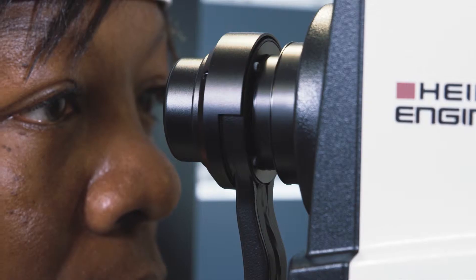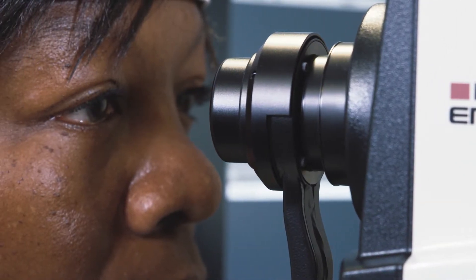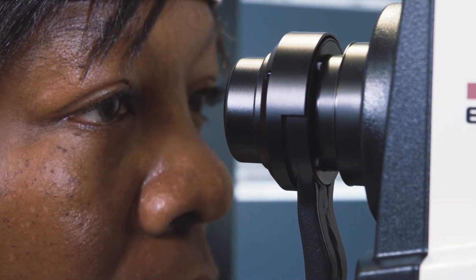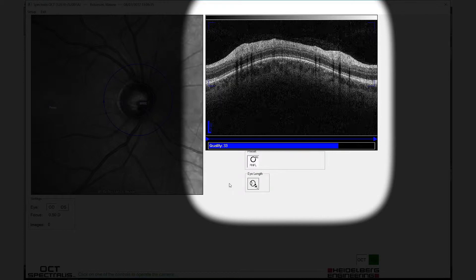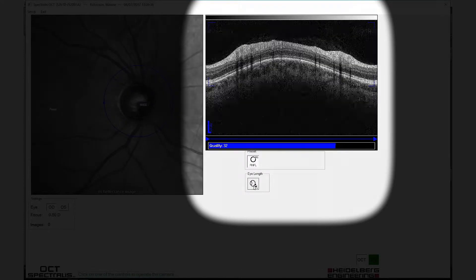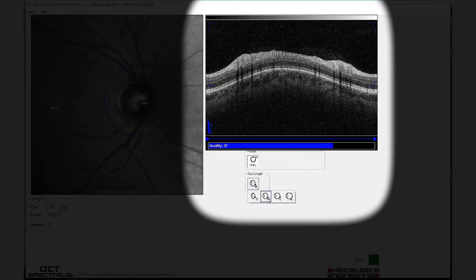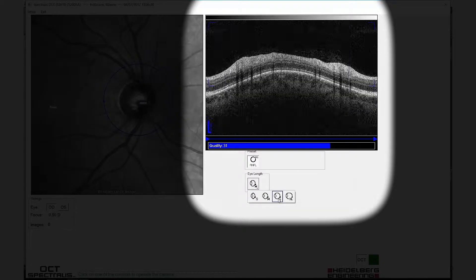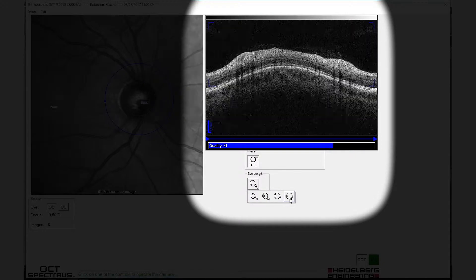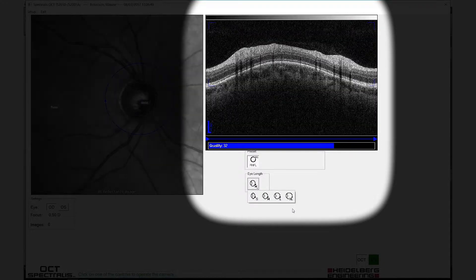The patient should be encouraged to blink normally throughout the examination. The axial length of the scan can be adjusted to reflect eye length and refractive error. This is of particular value when scanning patients with high degrees of hyperopia or myopia.